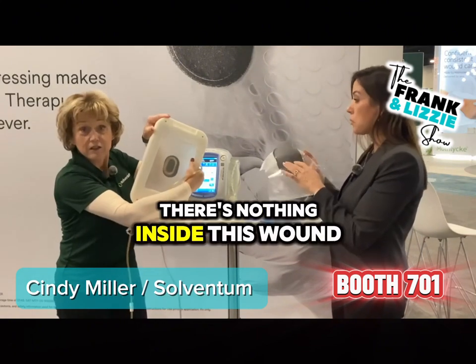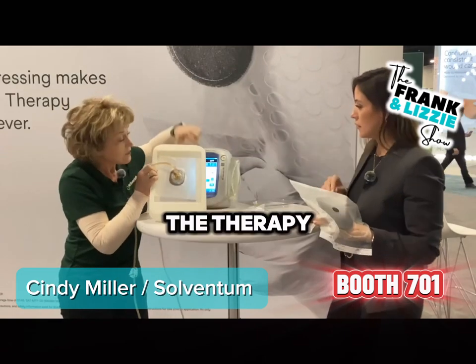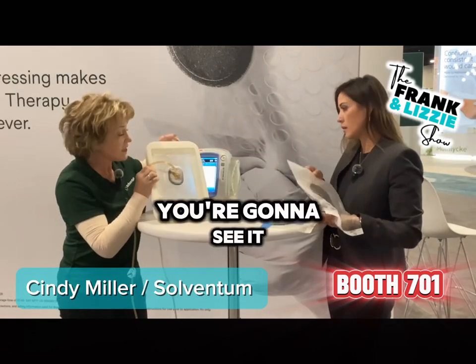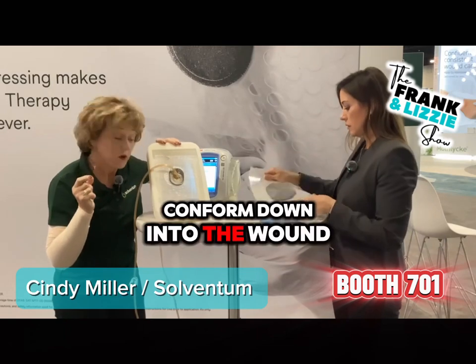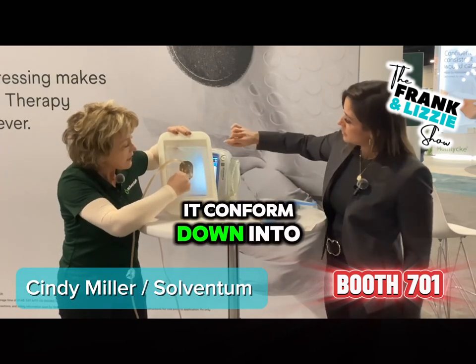There is nothing inside this wound. I'm like a magician, nothing inside the wound. So I'm going to activate the therapy. What you're going to see is you're going to see it conform down into the wound. And what's happening, can you see it? Yeah, I can see it. So you can see it conform down into the wound.